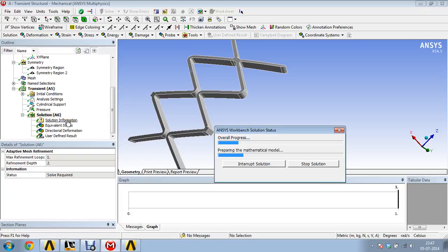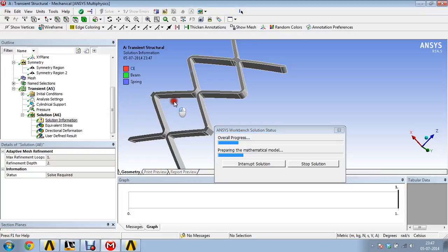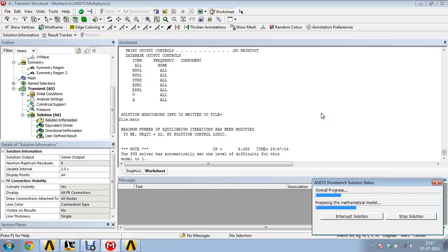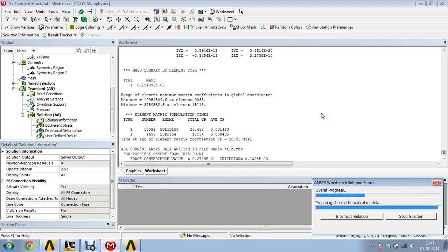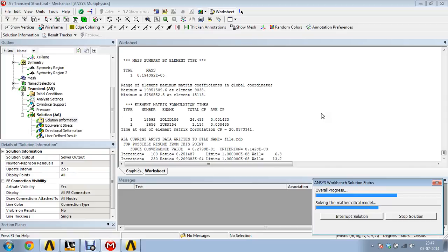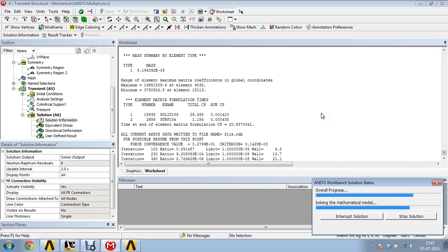You can go into solution information and see whether the solution is converging or not, and let us see. It would take quite some time. So the first iteration results are there. I think it will be converging because in the first iteration we have a force convergence value somewhat close to the criterion, and let us see what happens in subsequent iterations for force convergence as well as displacement convergence. Both of them should converge so that we can get proper solutions. And this would be an iterative solver. There is also another kind of direct solver.